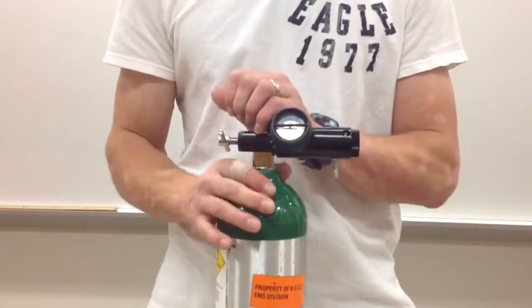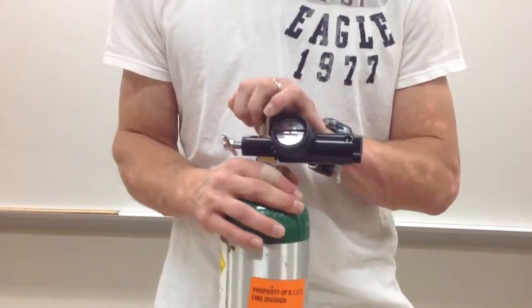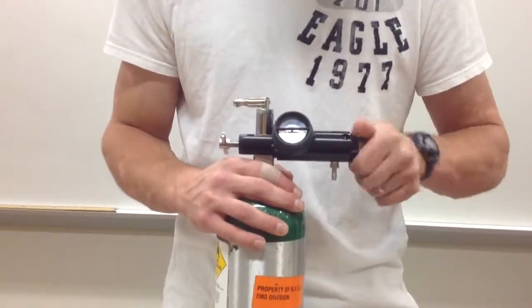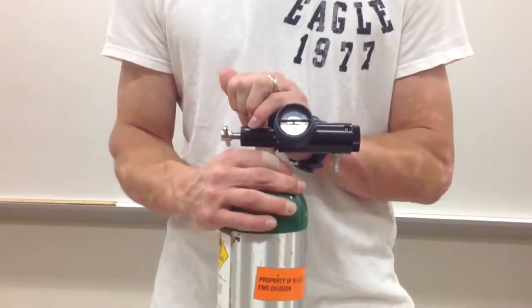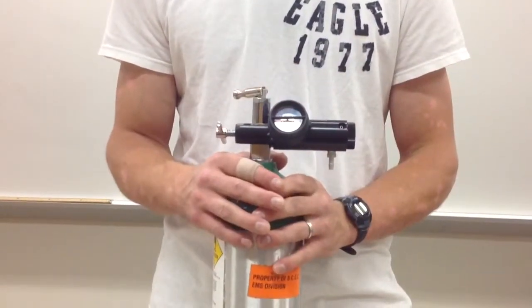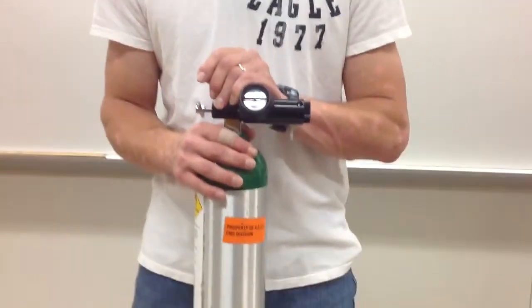Lastly, you're going to check if there are any leaks in the oxygen tank. In order to do so, open the valve on the oxygen cylinder and listen for any air leaks. If you do hear something, close the valve and try again.